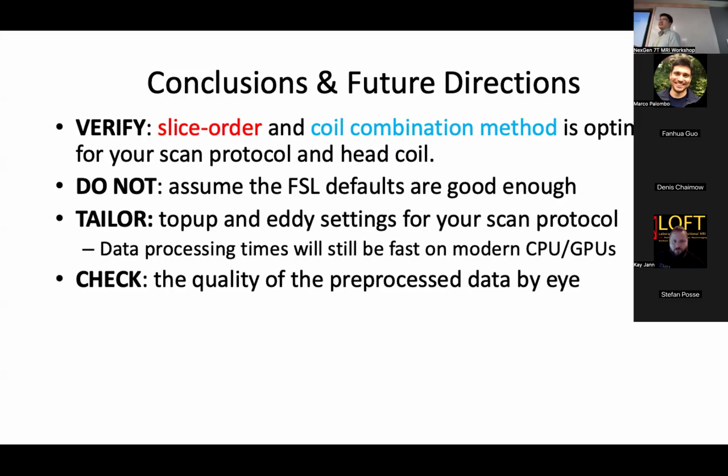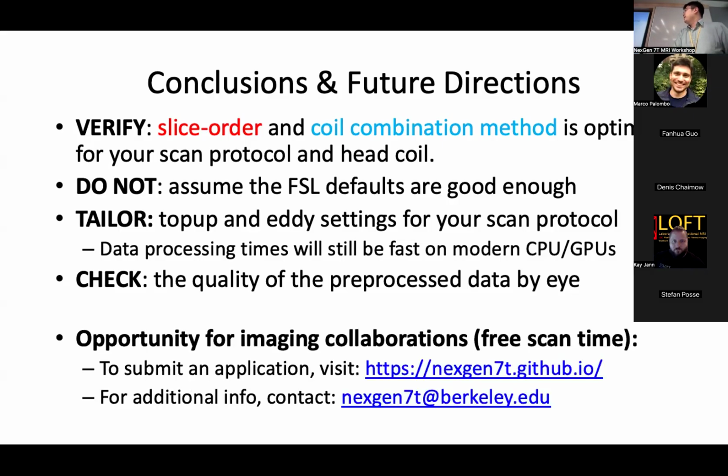So they can't see as much of the mesoscale as they would like. Of course, there's a whole list of possible reasons, but I just showed you a few, and those look like a pretty big deal to me. So just check all the processing steps to see if you can find easy things to fix and make sure it's as good as you want it to be.